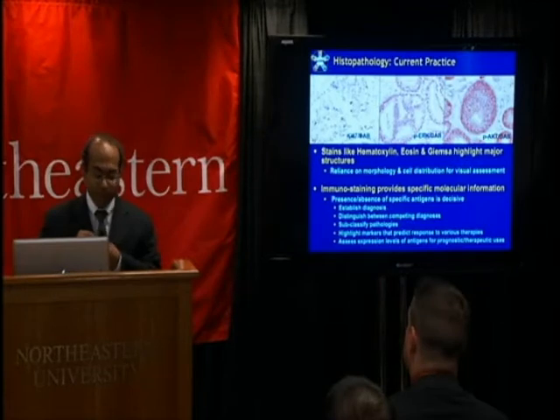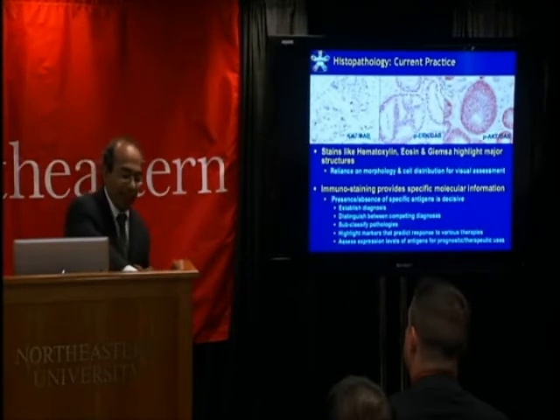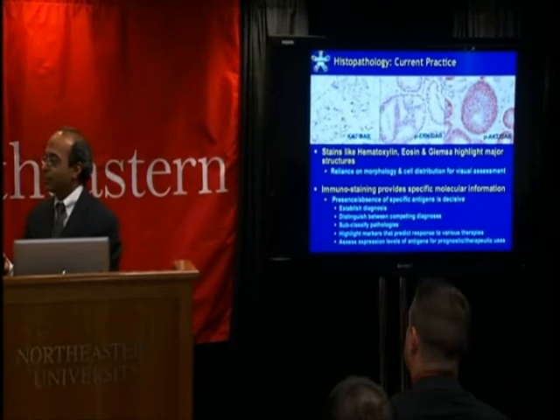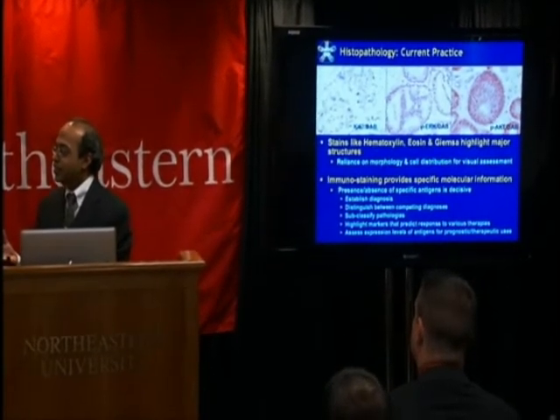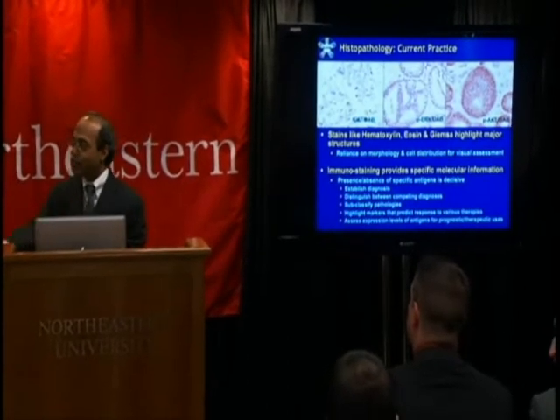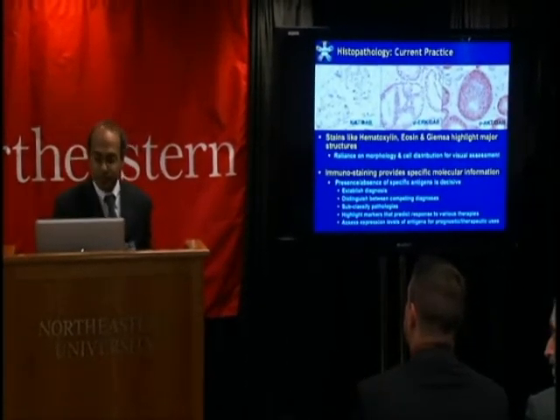So if you have a treatment that targets a particular molecule, you want to know its activation status. So if you can see that the molecule is activated, then yes, it's responsive, so go ahead and treat that patient with this disease.